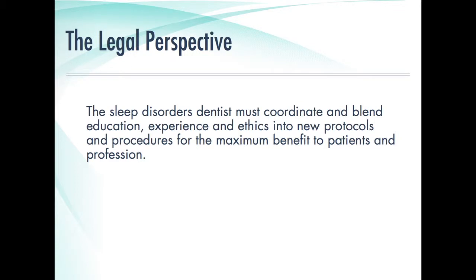The legal perspective, obviously, we cannot diagnose sleep disorders. We do home studies. Dr. Brass reads them for us. We're trying to be pioneers in this area because we know it's probably going to be forced upon us in a period of time. And for follow-up studies, they're very efficacious.